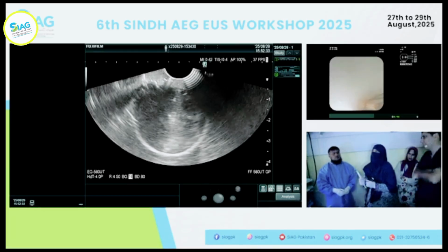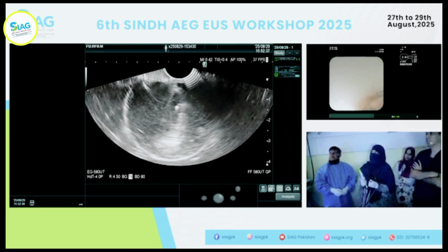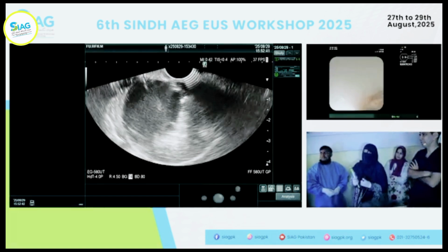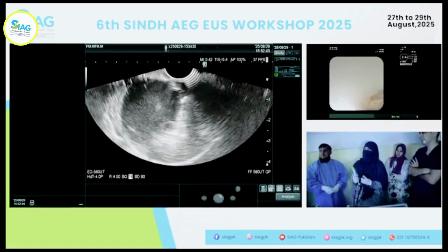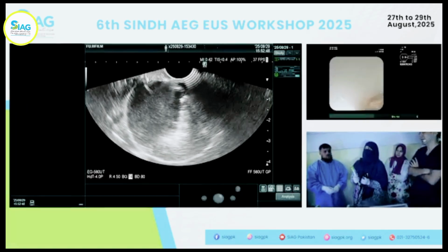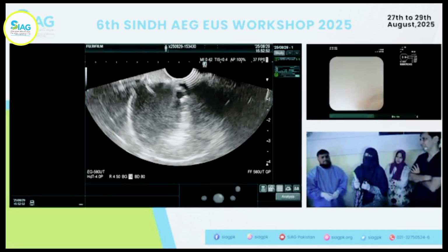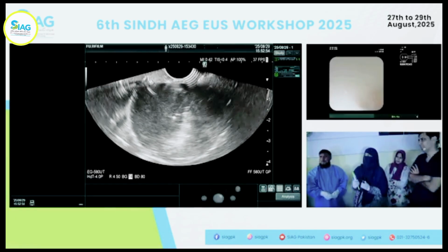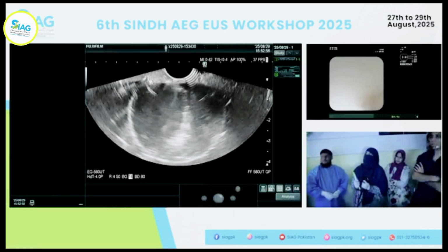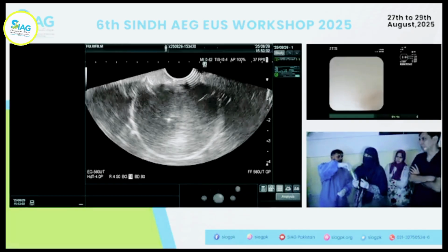Not for fanning. For fanning you'll use your elevator. Come back to the tip of the thing. Come back here. Yeah. Now big wheel up. Take the big wheel up, full up and down. See, it's moving, right? Do it more. So your direction is changed now. Use your elevator. See, the elevator is changing the direction. So you use these two things, the elevator and the large wheel, and you can actually do fanning.